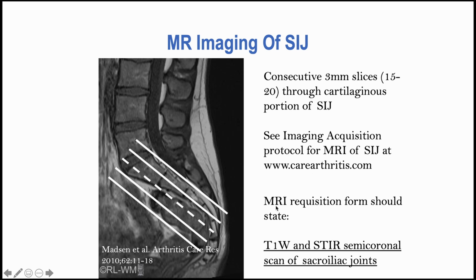It's important to state on the MRI requisition form that you are requesting a T1 weighted and a STIR semi-coronal scan of the sacroiliac joints. And for routine diagnostic evaluation, and especially in non-radiographic axial spondyloarthritis, it is sufficient to just evaluate the sacroiliac joints.